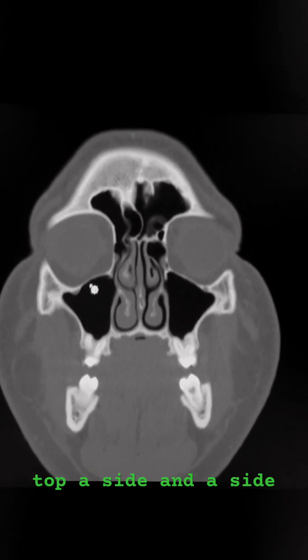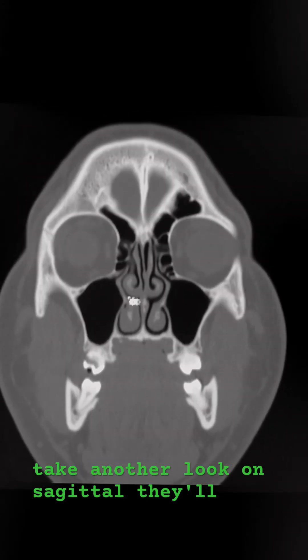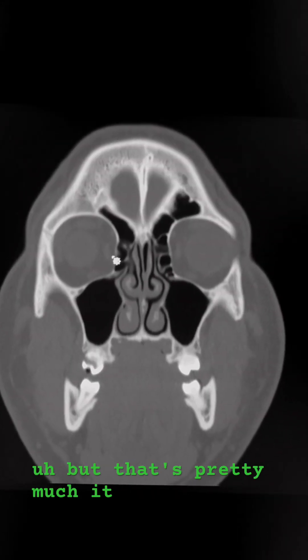The maxillary sinuses, which are right underneath the orbits, have a top, a side, and a side — they're kind of triangular. On sagittal, they'll have a more square appearance. But that's pretty much it there.